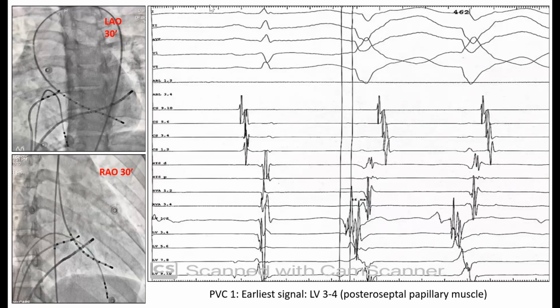3D in many third world countries is a luxury, especially where we work: Cambodia, Myanmar, Mongolia. They may have 3D, but many times lack technical support. They cannot have a 3D mapper with you all the time. Also, nursing staff and many assistant staff are not trained to do 3D mapping. So this is a limitation you're going to face in most of these countries. That's one of the reasons 3D is not available: lack of support and lack of training. That's why KCR is trying to address that issue. Okay, next.